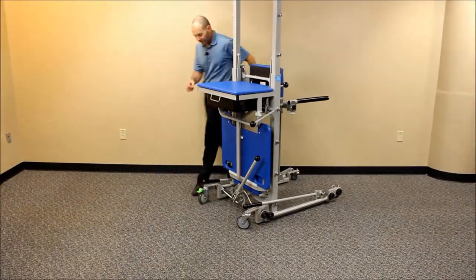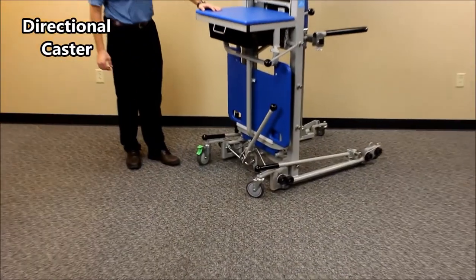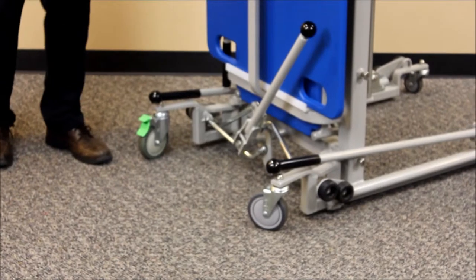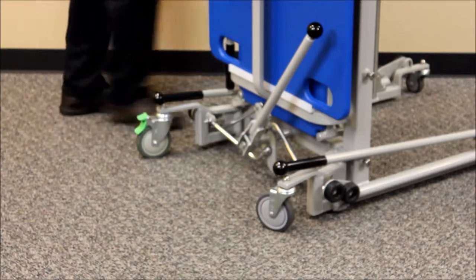One other feature to point out is a directional lock on the front caster. If you're going to be pushing this down a hallway or into a patient's room, that will lock the front wheel to one direction, making it easier to maneuver from the back wheels.